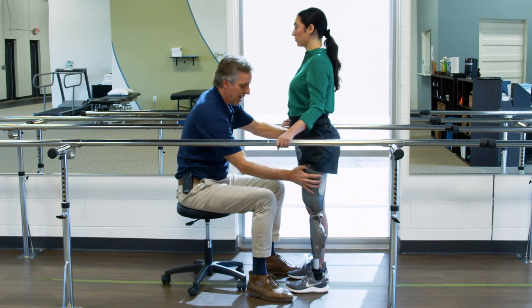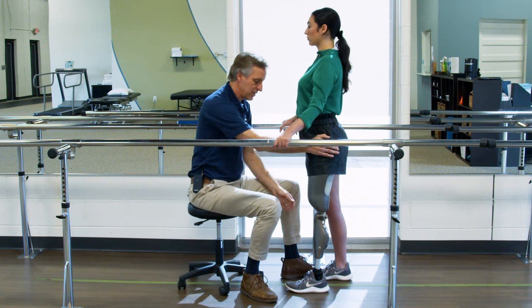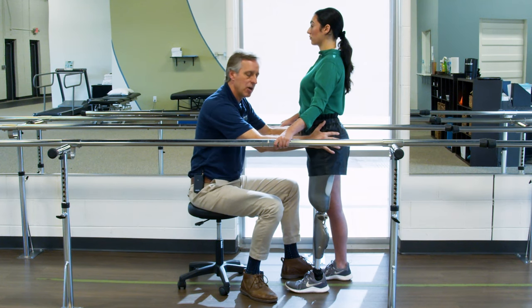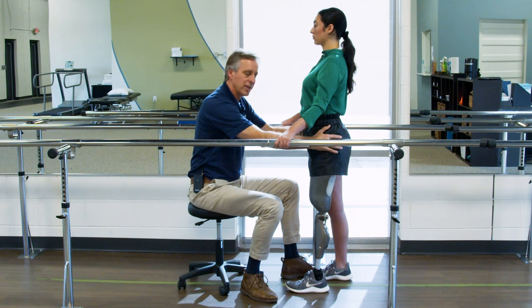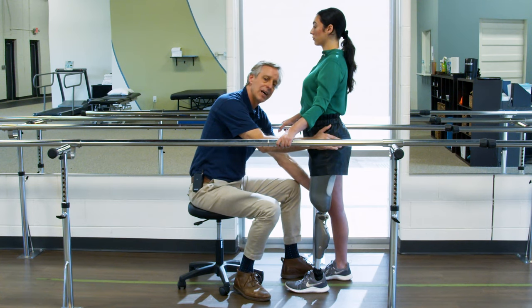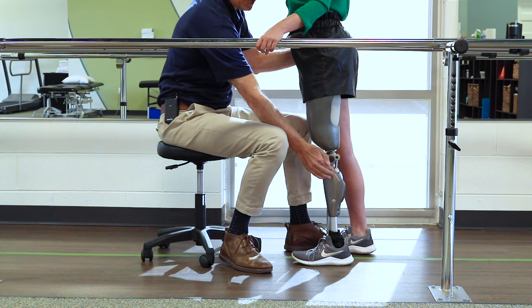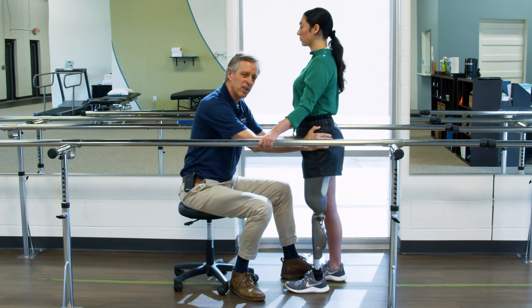Tracy, step back about half a step — that's plenty. She's in a position with the prosthetic a little in front of her, in a fairly narrow stance. Notice where my hands are on her pelvis; this is where the mechanics occur and I can help her get the confidence to put her body weight in the right position. I don't want to be standing back from her — I want to be where she can feel confident to really get on the prosthetic. What we're learning from the very beginning is how to load it, because all her weight is on her sound limb right now, and bringing that weight forward onto the prosthetic involves a trust factor.